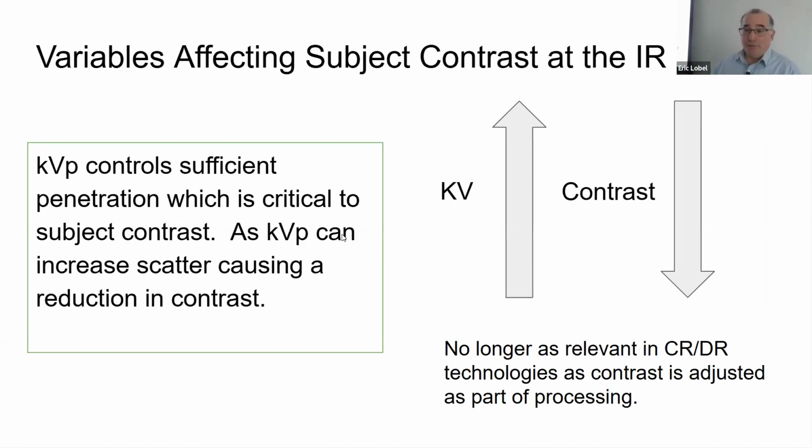KV up, contrast down, that's my t-shirt. I'll wear that when it gets warmer, even warmer than today.